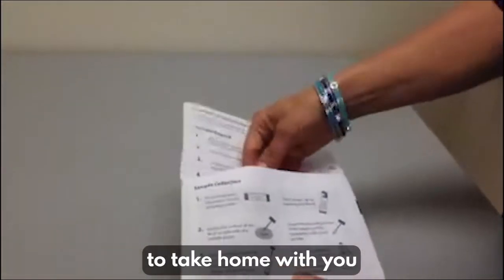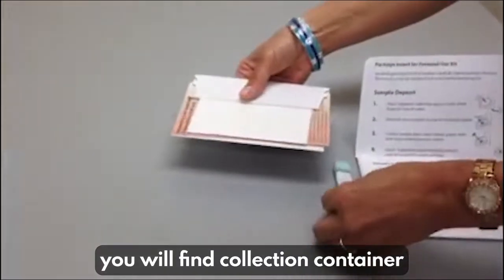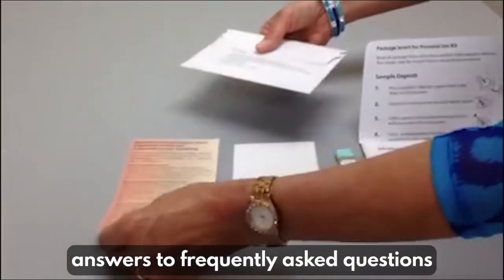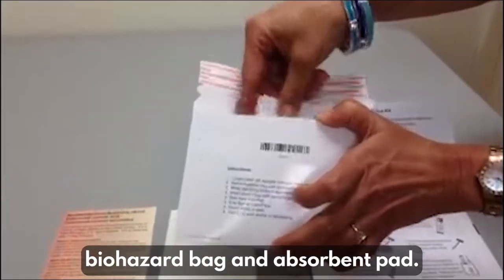You will get a package to take home with you. Inside the package you will find a collection container, collection paper, answers to frequently asked questions, a return envelope, biohazard bag, and absorbent pad.